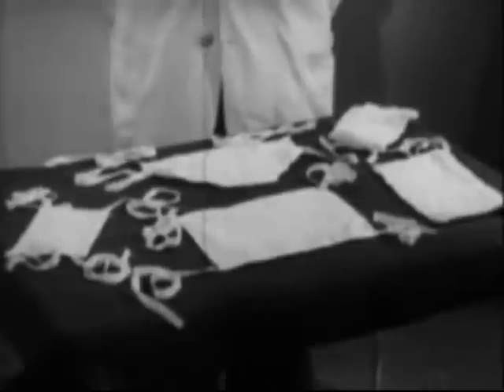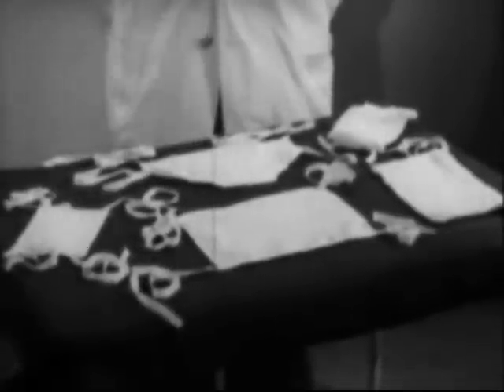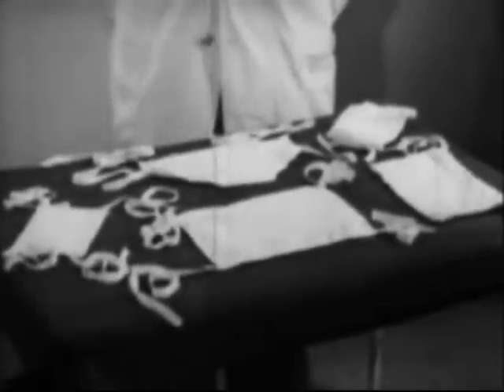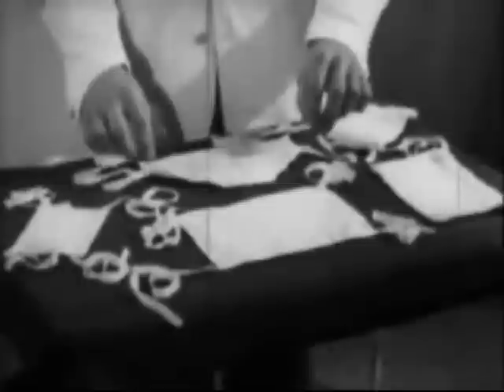When you cough or sneeze, whenever you talk, and even every time you breathe out, you expel small droplets of your saliva. In these droplets are many bacteria, and in hospitals you mustn't spit them all over the place. So you wear a mask to prevent that.